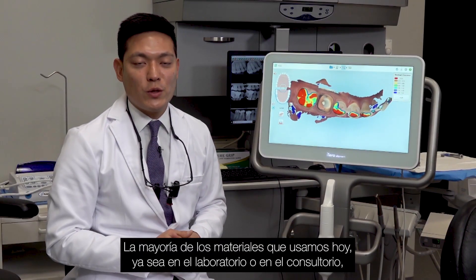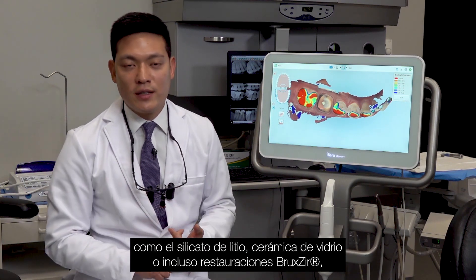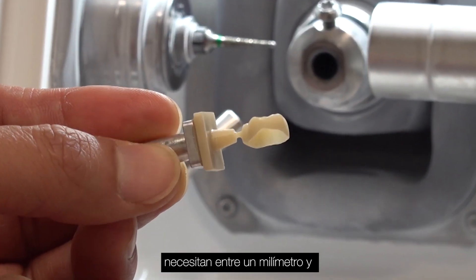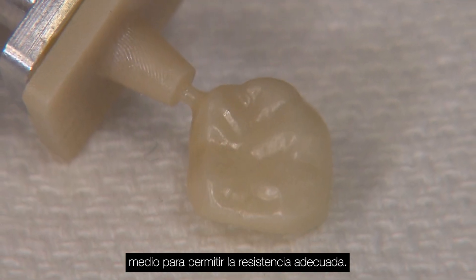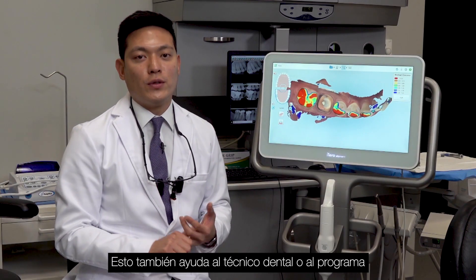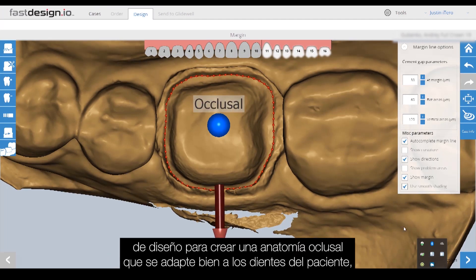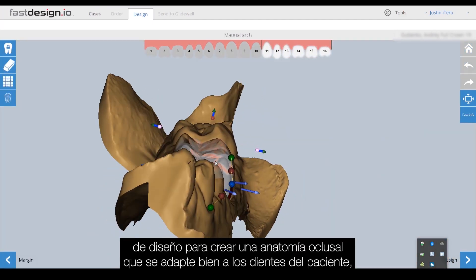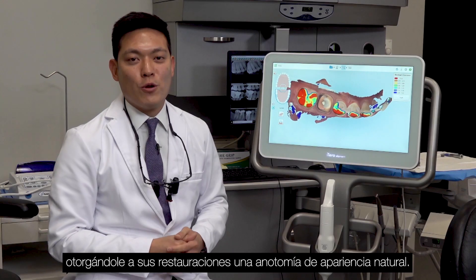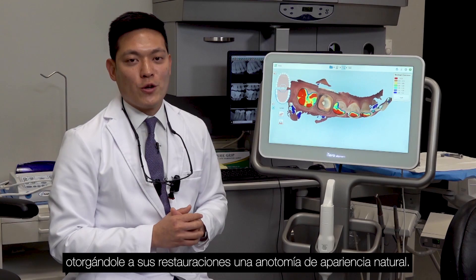Most of the materials that we use today, whether through the lab or chairside, like the lithium silicate glass ceramics, even with Bruxer restorations, one and a half millimeters is what we're shooting for to allow for adequate strength and also for the technician or the design software to create occlusal anatomy that conforms well to the patient's dentition. So it will give you more natural-looking anatomy on your restorations.